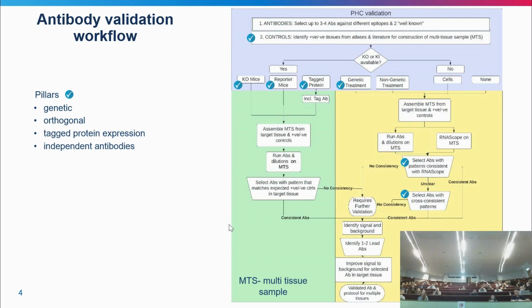Paired antibodies are especially important if you go to the brain and you have cells with long processes and you want to be sure that the processes that you see are indeed positive for this target.